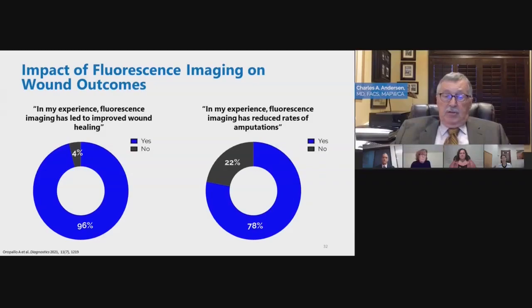When we look at our amputations in a limb preservation initiative, we know the etiology of diabetic foot ulcers, but the 2 factors that take a diabetic foot ulcer to amputation are, number 1, vascular insufficiency that can't be treated, but number 2, infection. So if all of a sudden you have that diabetic foot ulcer that becomes infected, that can be the trigger that then leads to amputation. With the early detection and treatment of bacteria, we prevent that, and I truly believe that we're seeing a decrease in the amputation rate because of that.